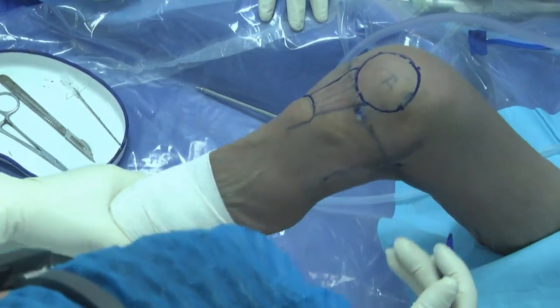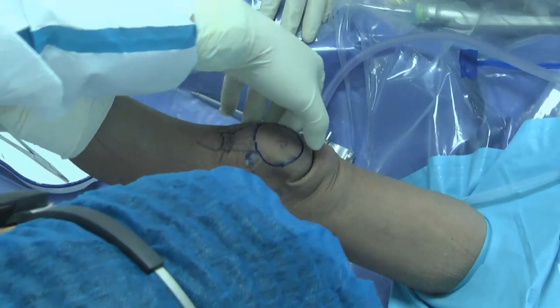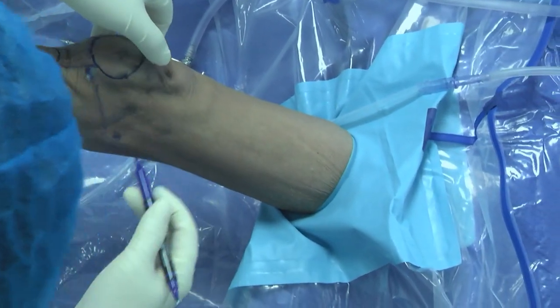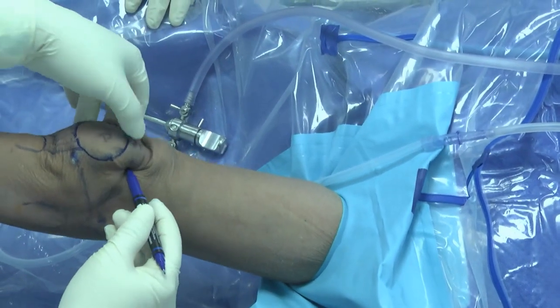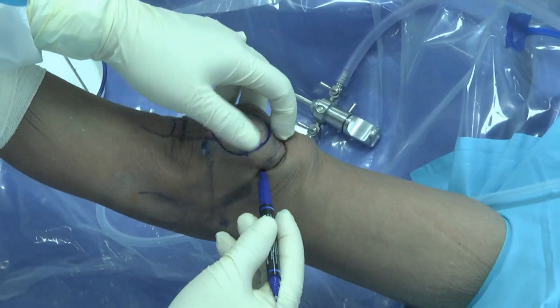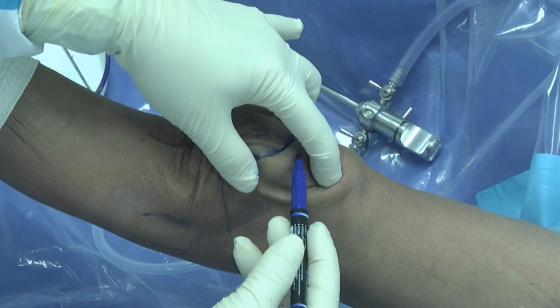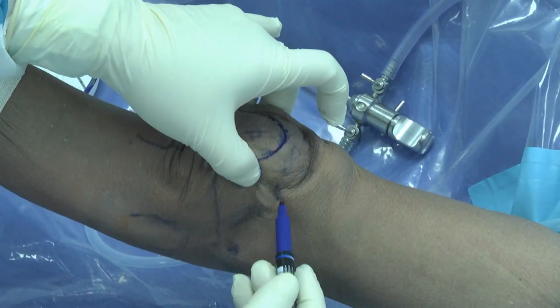Okay, so this is a lateral side. Another thing is you extend the knee. You extend the knee, and then you can feel this is the upper pole of the patella. 然后是髌骨上棘。Okay, so this line, the upper pole patella, you're going down. This is the superolateral portal. 这是上外侧的通道。It's about two finger breadth from the top of the patella.